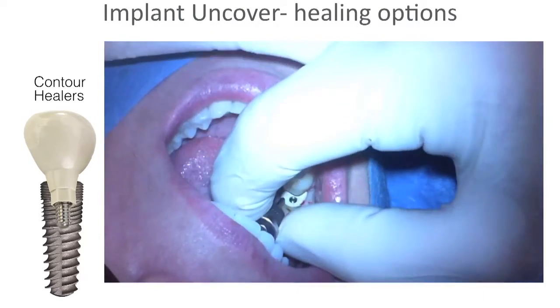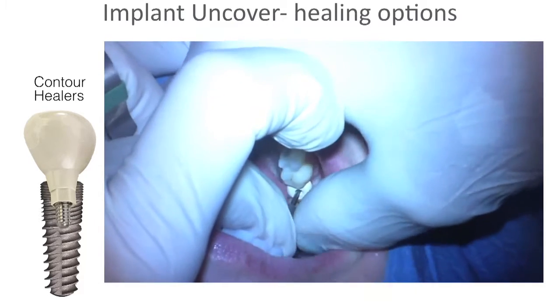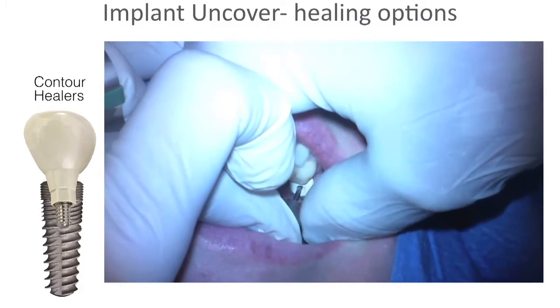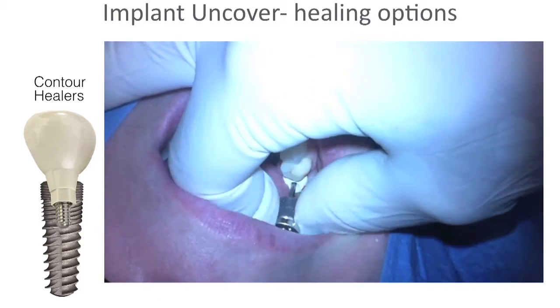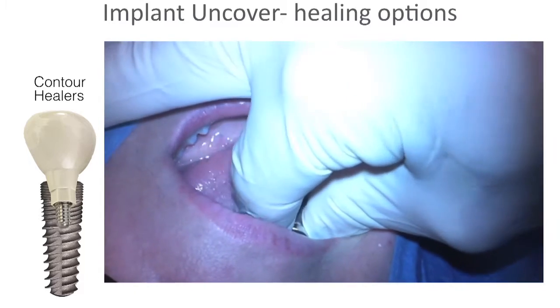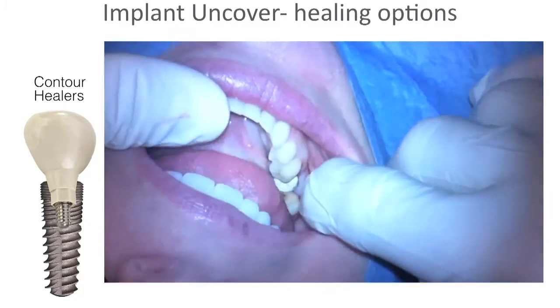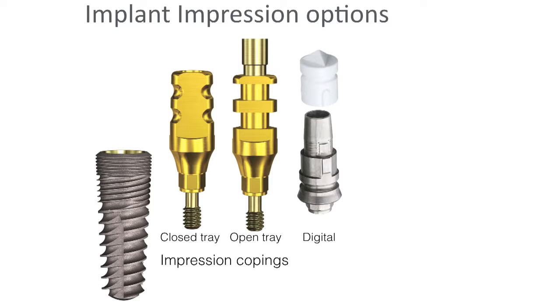All right, contour healers. This is an example of a contour healer. You arrange it in a way that it would fit most like an implant or a tooth or a crown, and it gives you this pre-contoured area. So it helps pre-shape the tissue for your final restoration, and it looks great because once you have it, your tissue is oblong like a crown is, and then when you take your final impression, you can just copy that. That's what it looks like. Works really well.